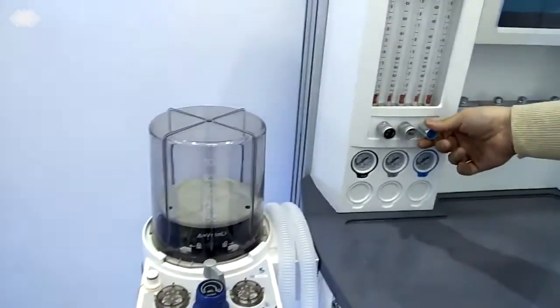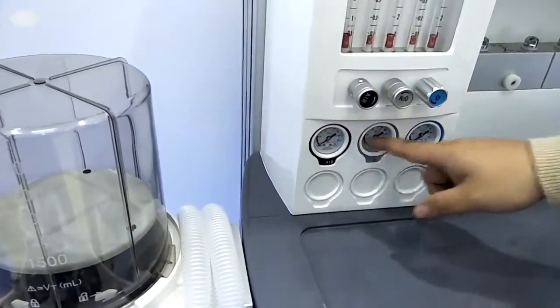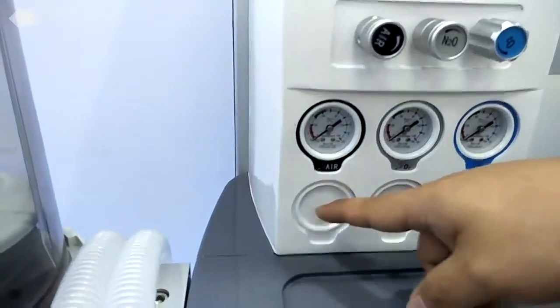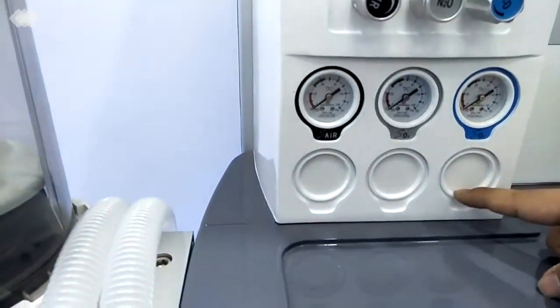Just rotate it, very easy. Under here, there are a total of 6 gauges. The first 3 are checked when you are using the cylinder, and the second 3 are used when you are using the central gas supply or central oxygen supply.